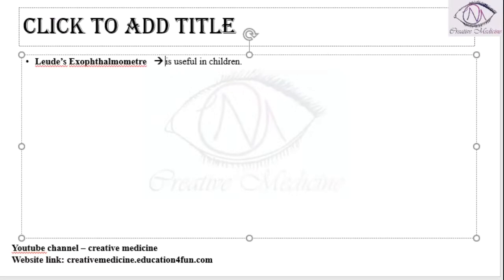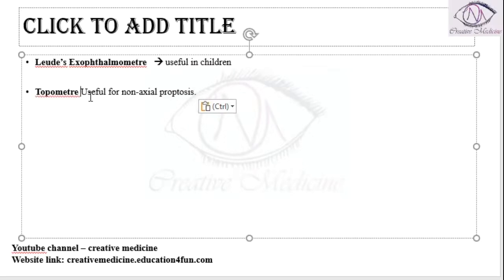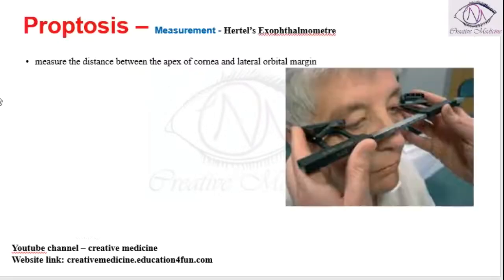This Luedde's exophthalmometer is actually useful in children. Similarly, we also have the topometer. This topometer is mainly useful for non-axial proptosis.